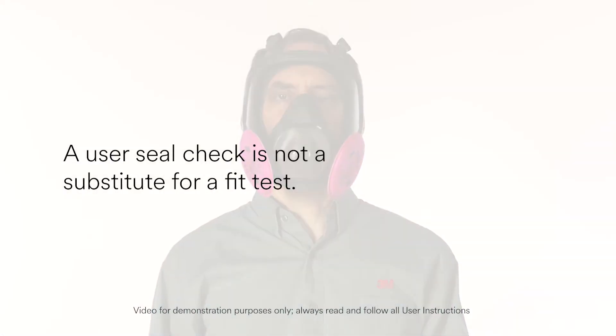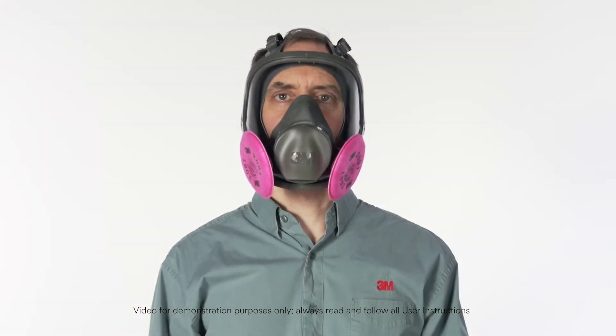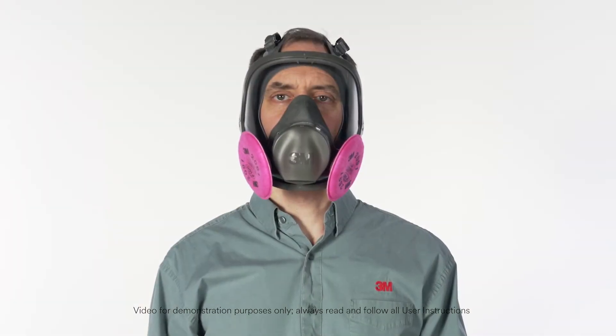Remember, a user seal check is not a substitute for a fit test. It is very important that you are fit tested annually to be sure the respirator is capable of fitting you properly.